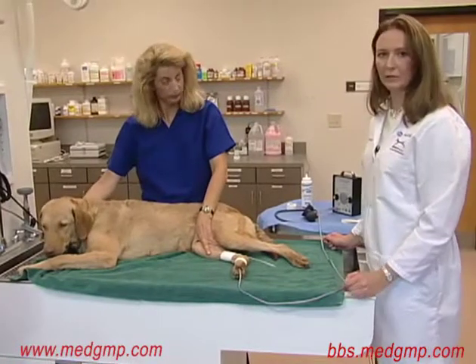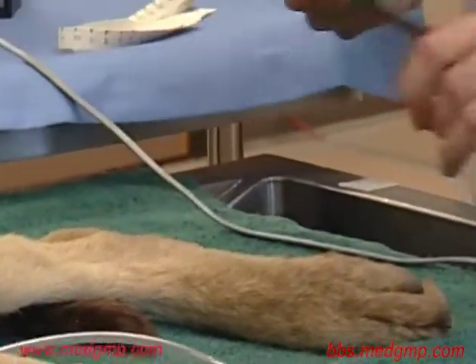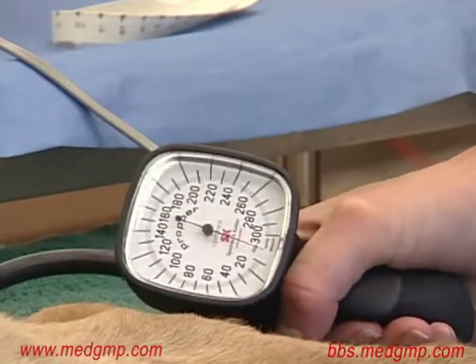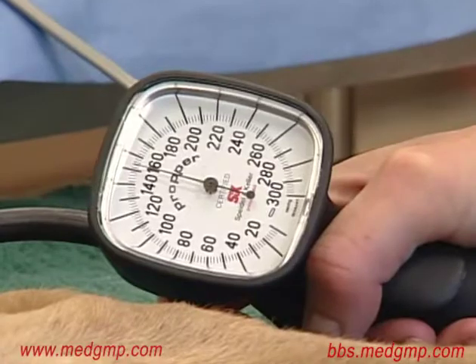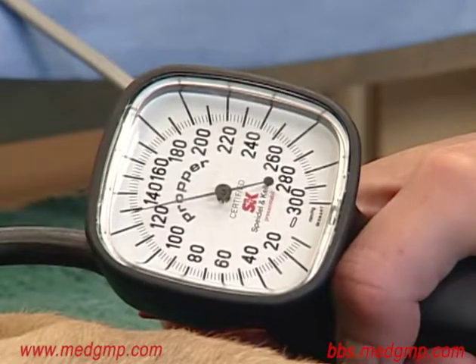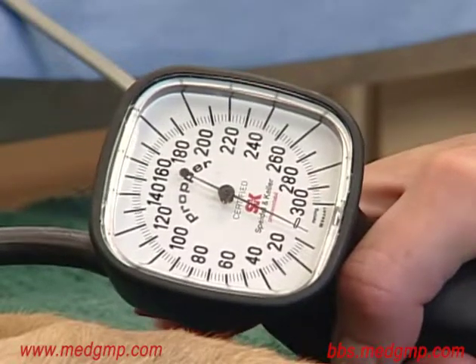Once you have a good reading on the Doppler and can hear the sound well, go ahead and connect the sphygmomanometer. I'm now going to inflate the cuff until the sound disappears, about 20 to 30 points past the sound disappearing. I'm then going to slowly release the cuff until the sound reappears, accomplished by slowly releasing the red button. The point at which the sound returns is the systolic blood pressure — in this case around 115 millimeters of mercury.